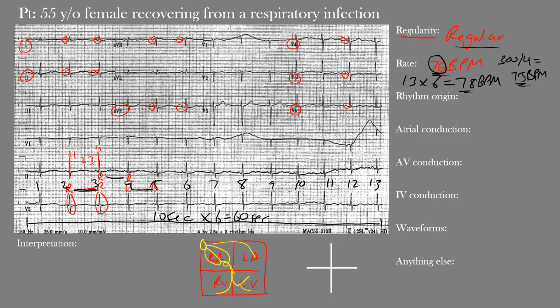Okay, and why we say it will be heading in this direction, or we'll see it in those leads. So let's put our leads here. Okay, so imagine this is our sinus node, okay, and if things are firing, it's going to be heading in this direction. So if we use this, it would be heading in this way, all right, and where lead 1 would sit would be right here in our frontal plane. This would be AVF, okay, AVR is here, okay, and then we can also add lead 2 here, lead 3, okay, as well, and then we can add some of our precordial leads, V4, V5, and V6, okay?